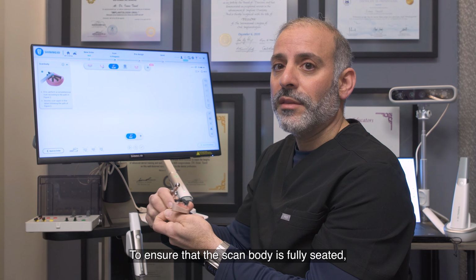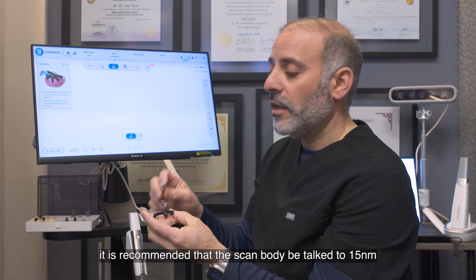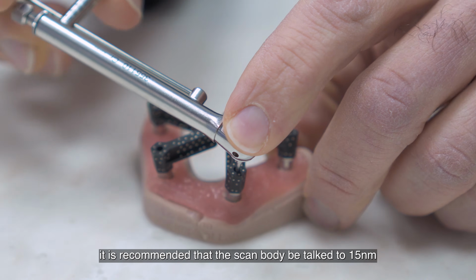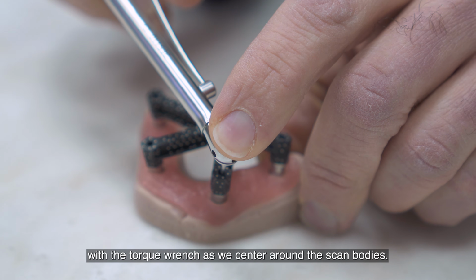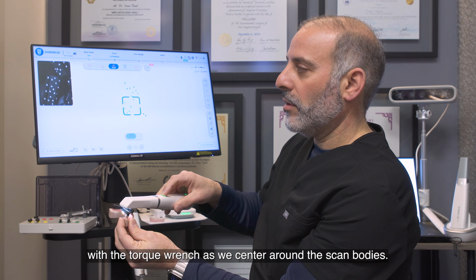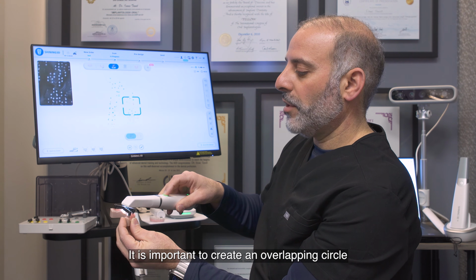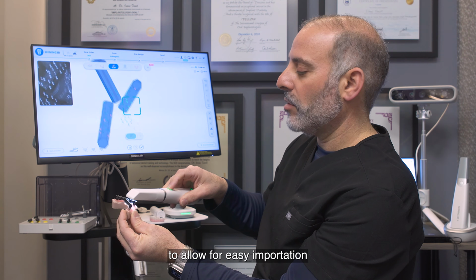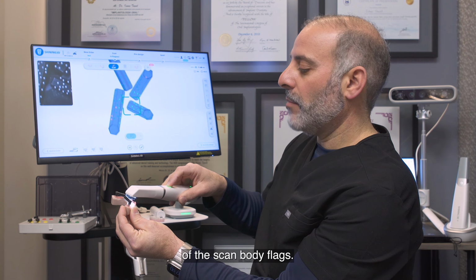To ensure that the scan body is fully seated, it is recommended that the scan body be torqued to 15 newtons with the torque wrench. As we center around the scan bodies, it is important to create an overlapping circle to allow for easy importation of the scan body flags.